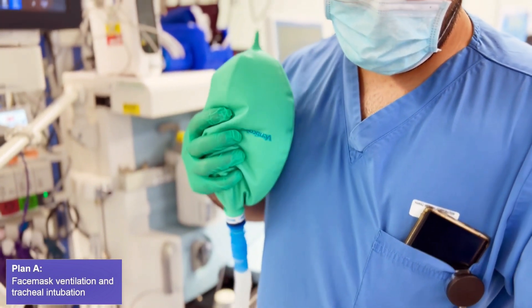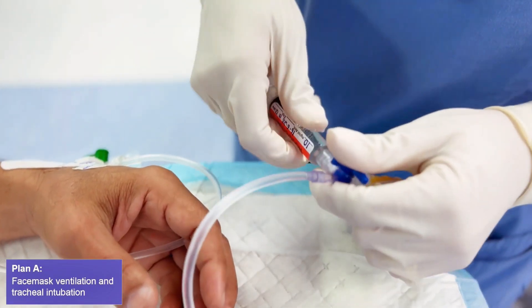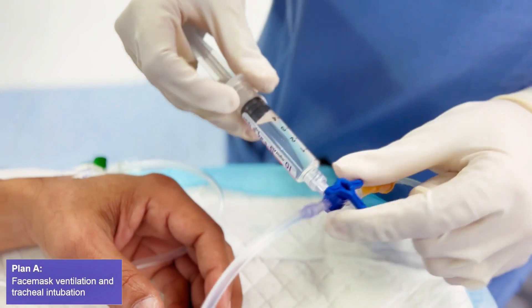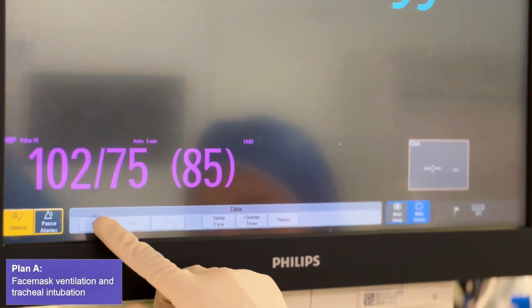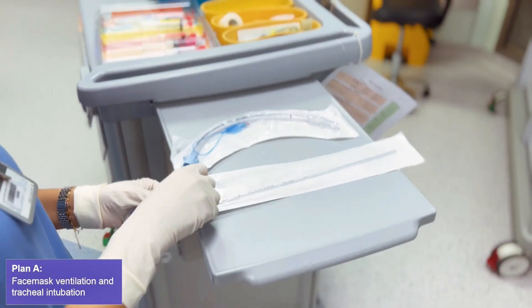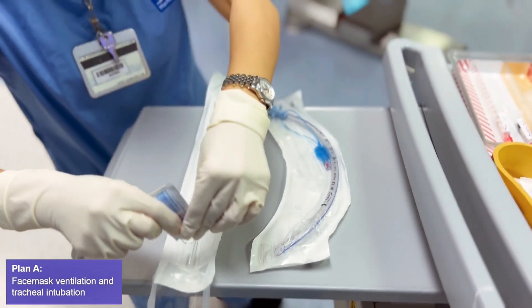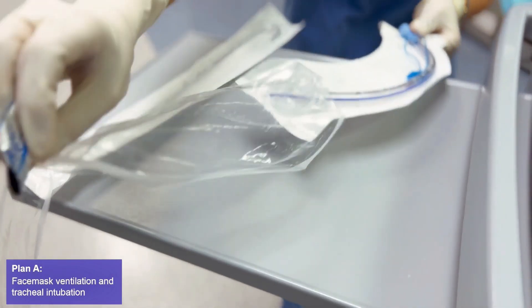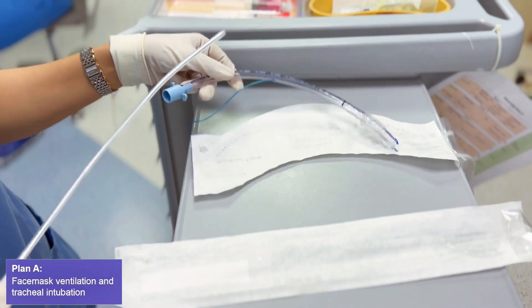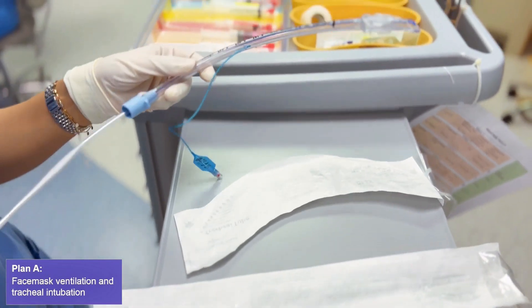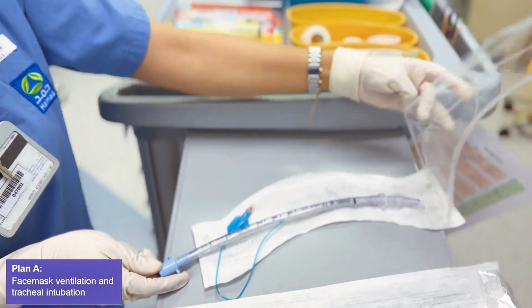Check ventilation and then give adequate muscle relaxant. Start the timer. Apply enough lubricating gel to the stylet and the endotracheal tube. Insert the stylet into the tube and adjust the curvature.